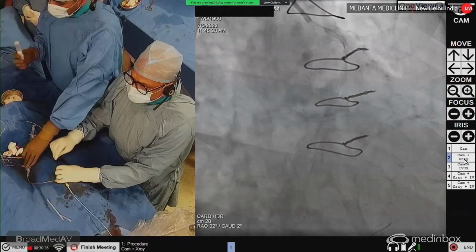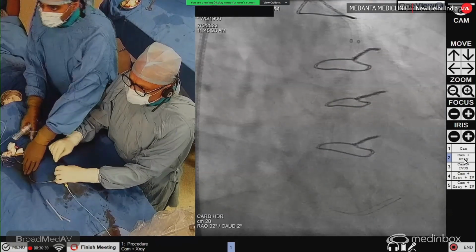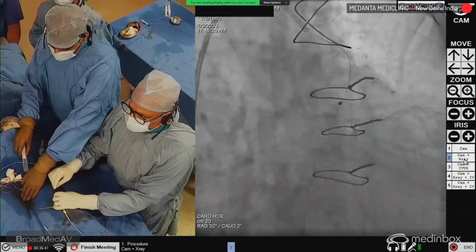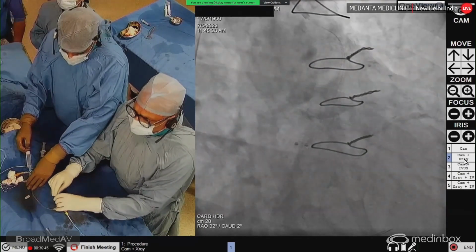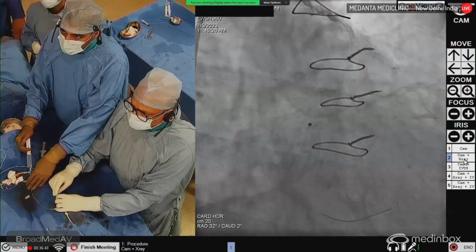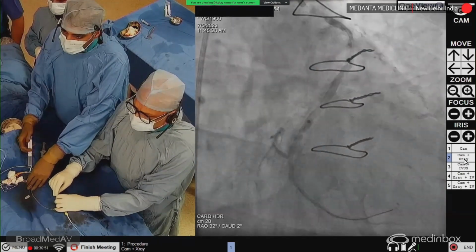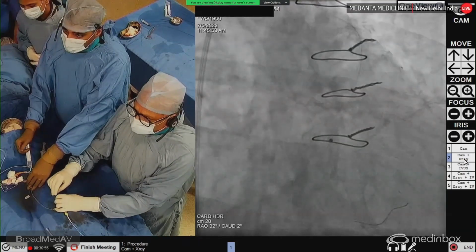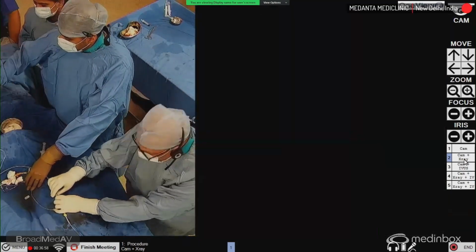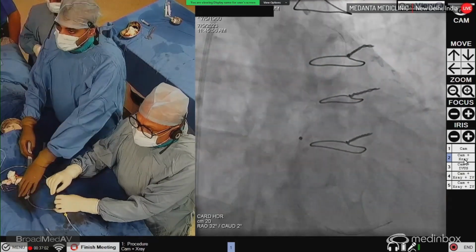So let's see whether this catheter goes easily or has some difficulties. Up till now, so far, smooth. Yeah, okay. Maybe we can check now. Check please, a little bit. Yeah, it's okay. So we can do that. Okay. Right, okay. Flush it. Flushed. Are you flushing? Yes. Okay. So we have flushed, and we'll do some runs here.